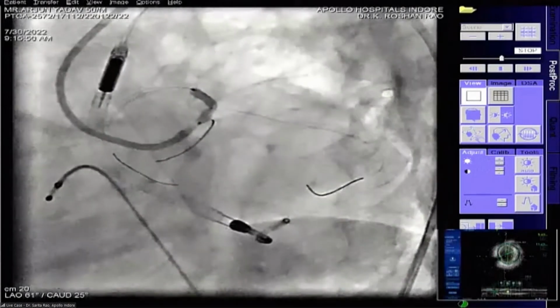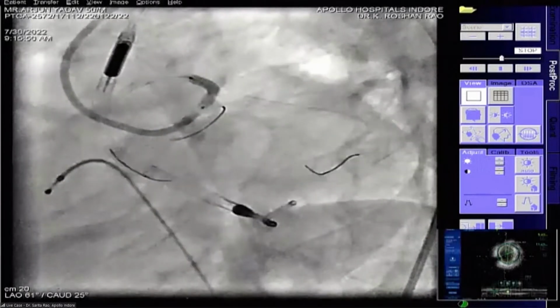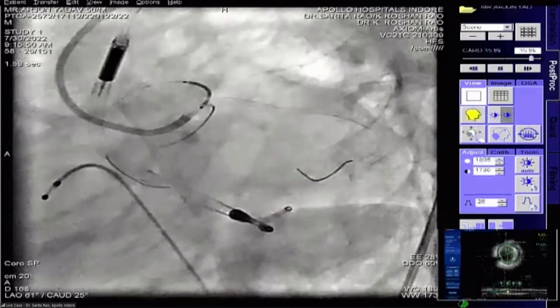As you mentioned, Ramesh, this platform where the stent starts from, the marker is again an advantage in placing at the ostium. For the differential expansion, she's preferring the other balloon.